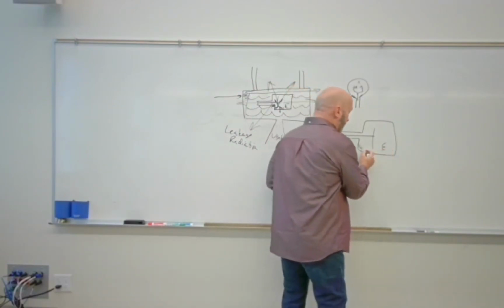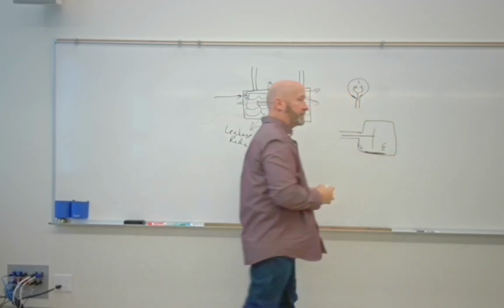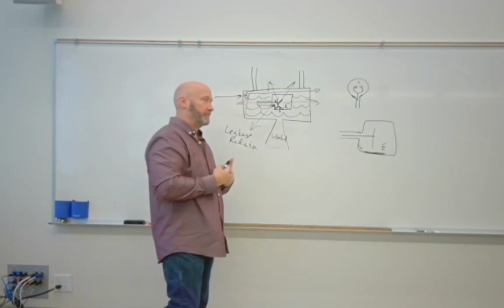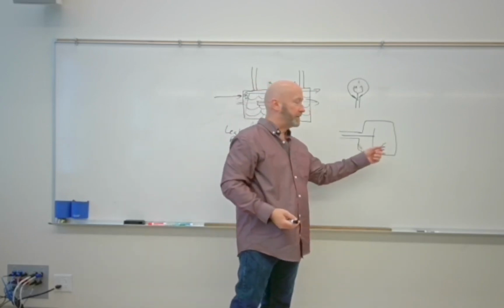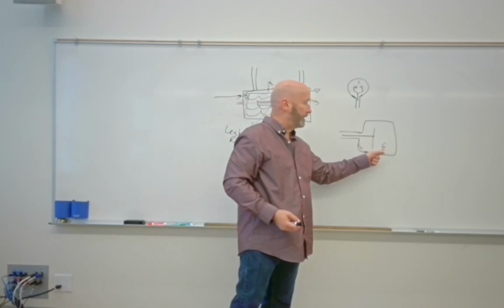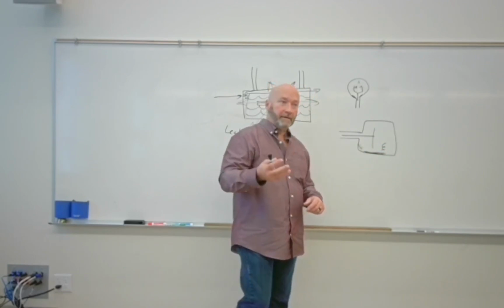But what if we coat that thick enough? Might it change the electrical character, the conductivity characteristics of the X-ray tube? Might those electrons travel instead of from here to here, then go from here to here? Yes. The answer is yeah, right?